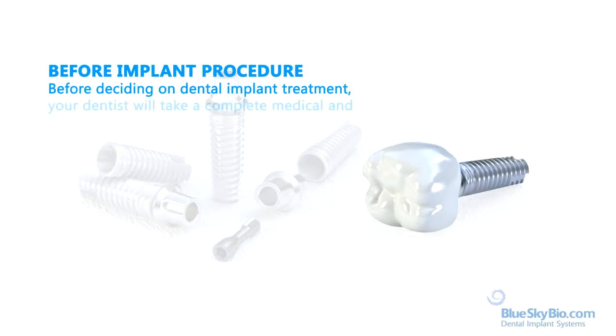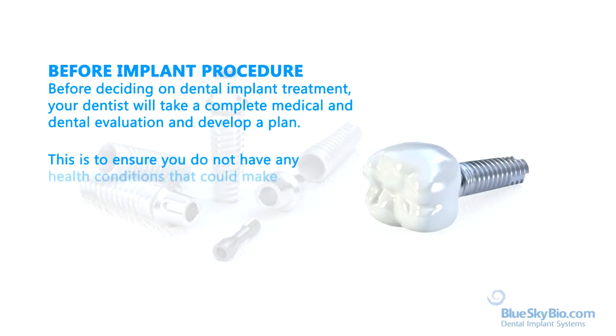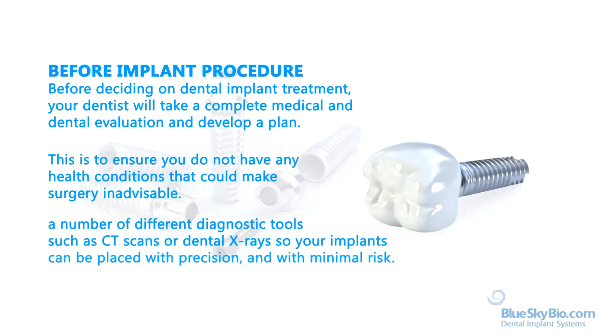Before deciding on dental implant treatment, your dentist will take a complete medical and dental evaluation and develop a plan. This is to ensure you do not have any health conditions that could make surgery inadvisable. In addition, the dentist will use a number of different diagnostic tools such as CT scans or dental X-rays, so your implants can be placed with precision and with minimal risk.